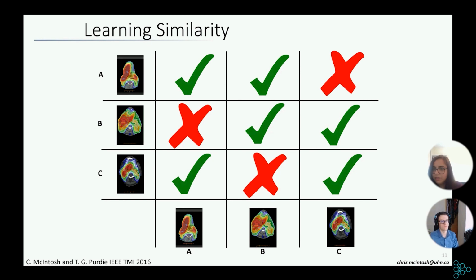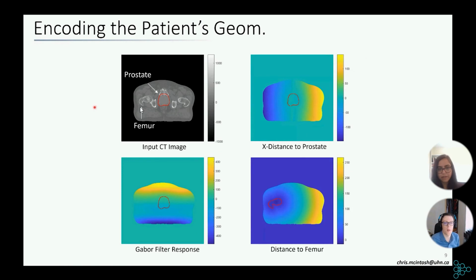Would you train your model differently for treatment areas with more risk of changes in anatomy, like abdominal treatments where bowels can move? That's a great question. That's already built into the care. When they do the prescription, part of it includes something called a margin. On the prostate, for example, they use a 5 mm margin. You'll notice the delineations are a little bit larger. They go about a 5 mm ring around that, and they have to treat everything within that ring to account for patient setup errors or movements. So that's built into the model.